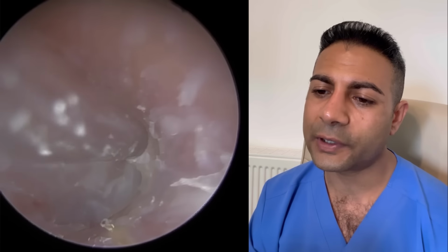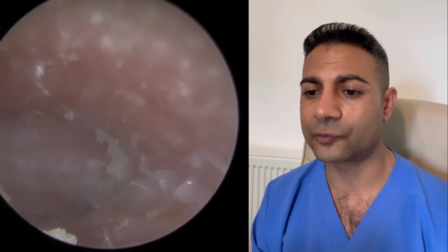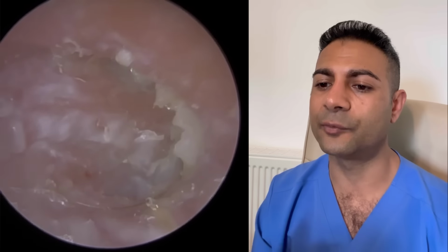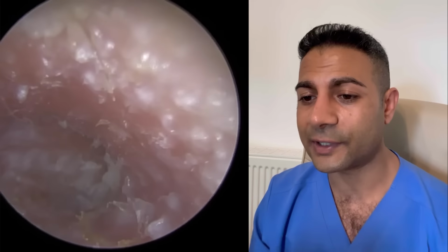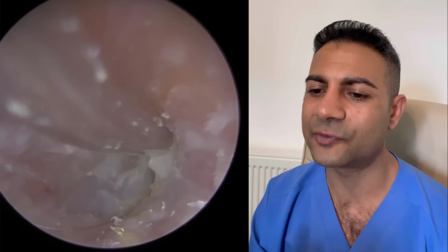So it's just working away, so we can see the eardrum now. Sorry, I've probably talked a lot about the condition of the ear and less about the procedure, but I'll just recap, summarize what we're doing. So I was just peeling away all these multiple layers of dead skin off the canal wall. You can see the skin, it's irritated, it's inflamed, it's slightly swollen.